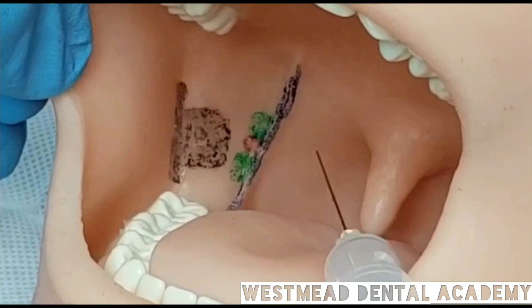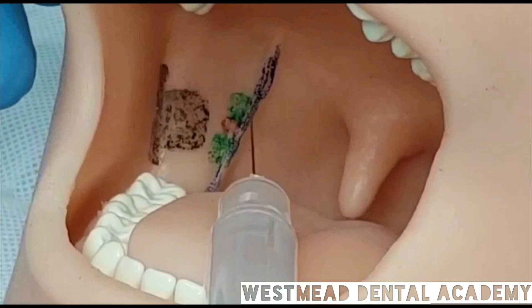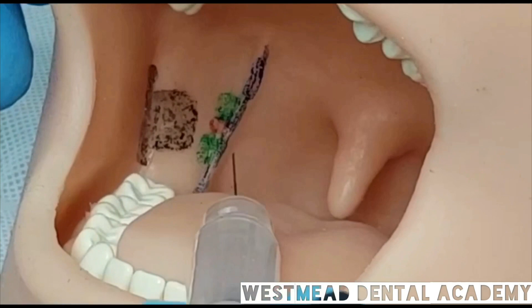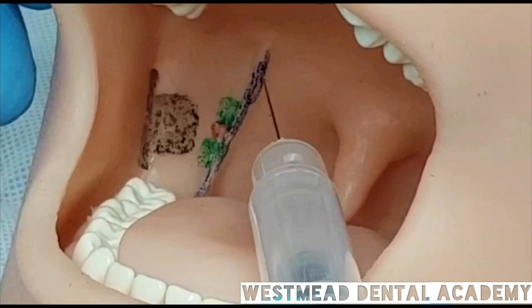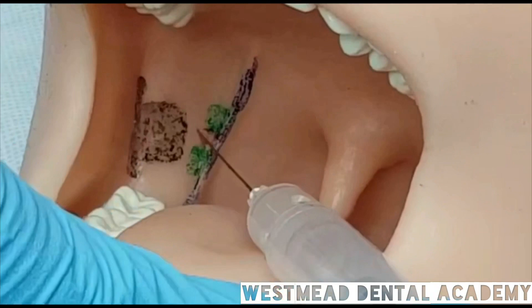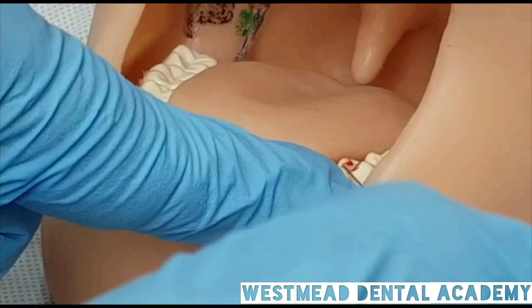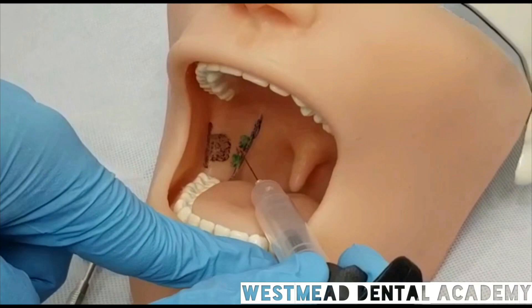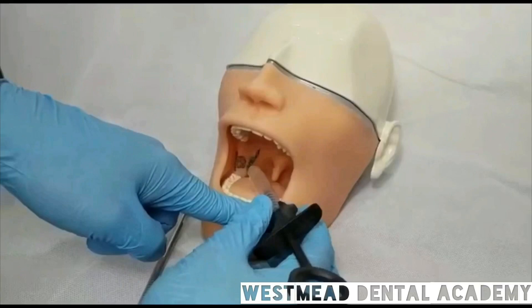So, to do the proper technique, we need to follow some steps. Number one, you have to divide the fold into two equal halves — upper and lower — and then you have to inject into the red point, which is only 1 millimeter laterally away from the fold. After doing this, you actually need to place the syringe on the premolars on the opposite side. We have already marked the premolars for you. Place the syringe on the premolar, and then progress the needle gently into the red point to hear the beep. Once we hear the beep, that's great.